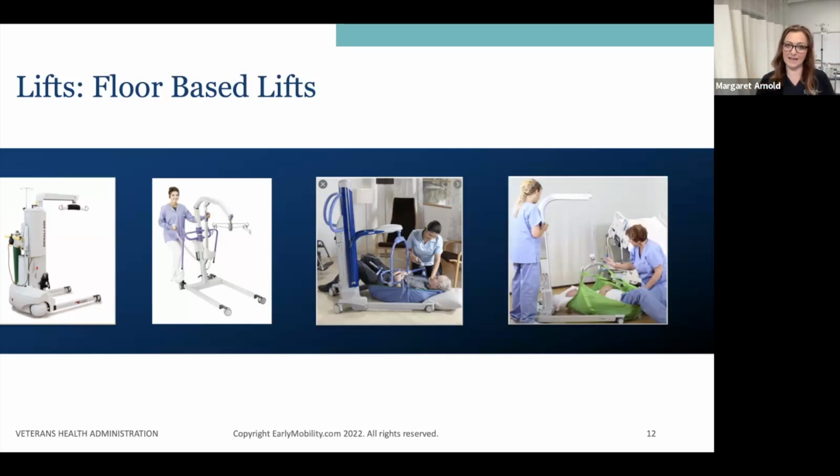You see that on the second lift. The third floor-based lift you see has what they call a dynamic positioning system. It is a clip style with a different point of attachment for the sling to the lift. And then the last lift on the right, you will see has the 2-point hanger bar that moves all the way to the floor with the hanger bar on the belt.